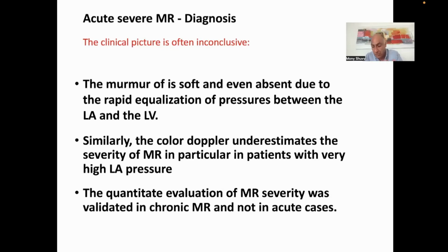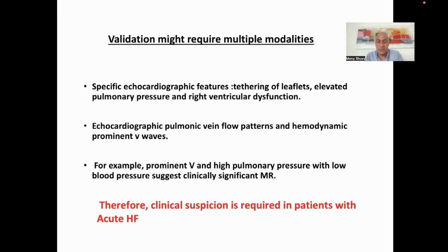And in most cases, the usage of this quantification underestimates the acute severity of the mitral regurgitation.